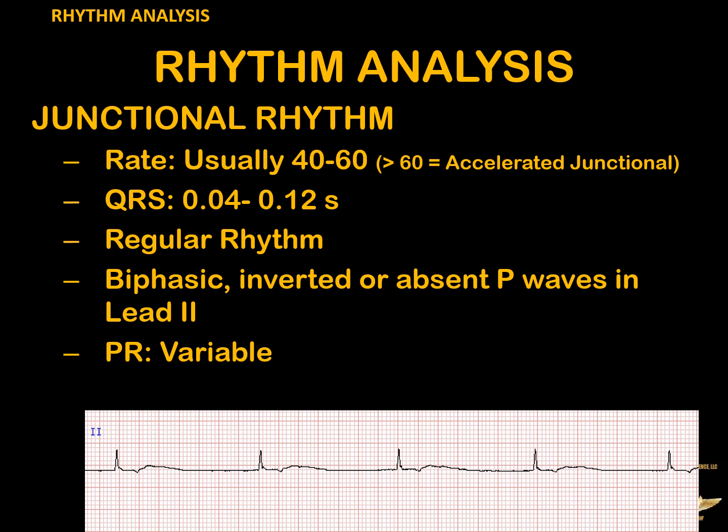Treatment for this will usually be based on the rate. If it's too slow, you'll need to do something to speed that up. But that's usually uncommon. The most important thing here is to recognize that it's not a sinus rhythm just based on the idea of those P waves.